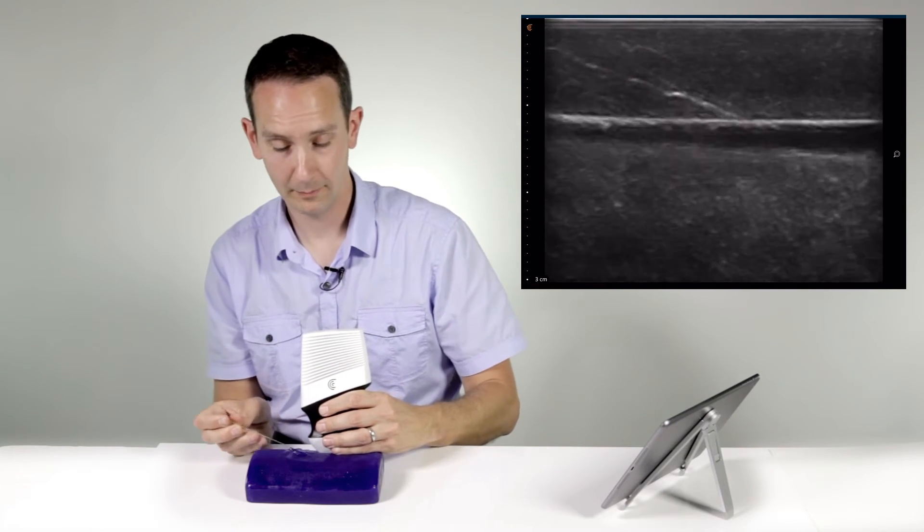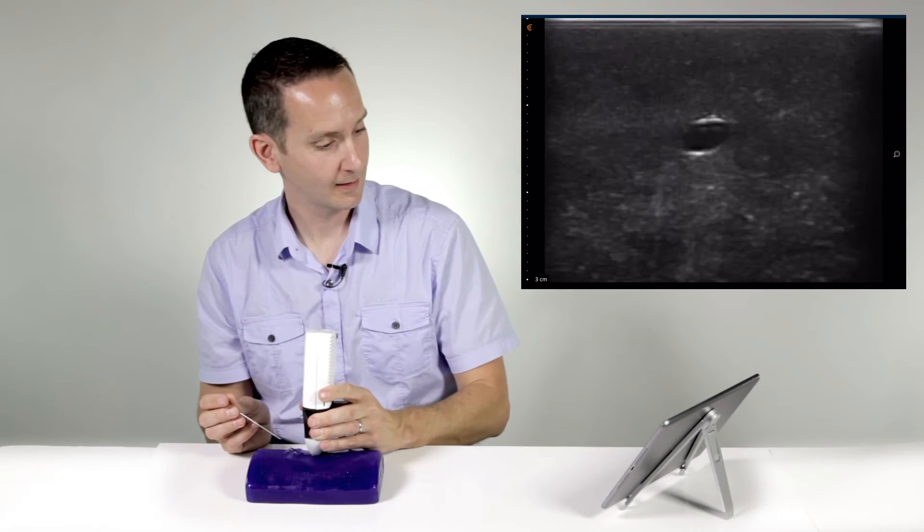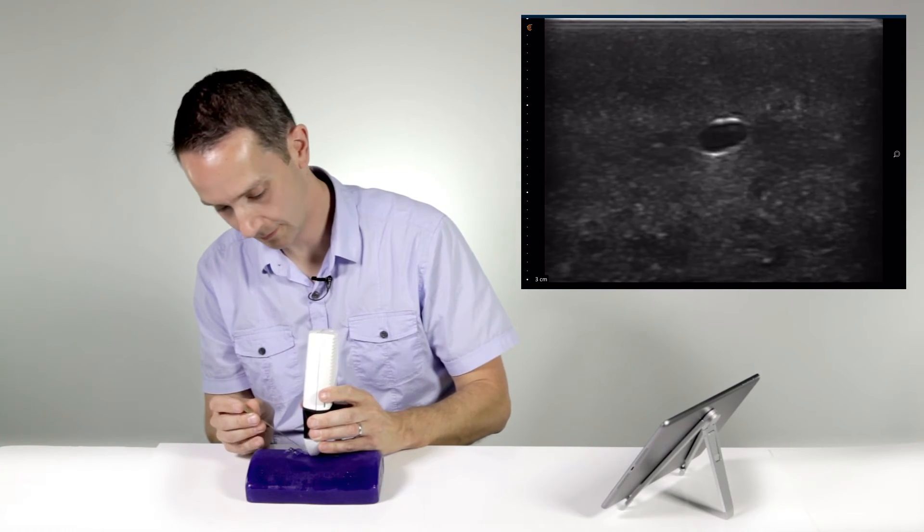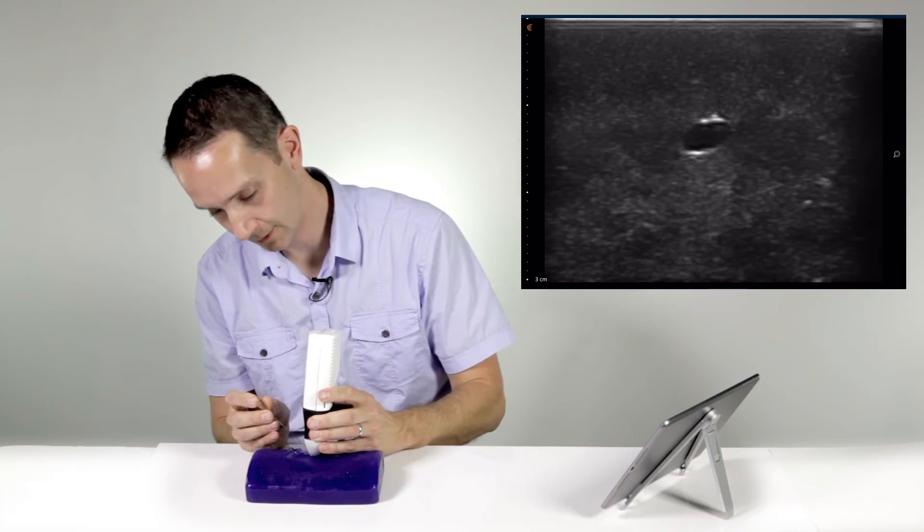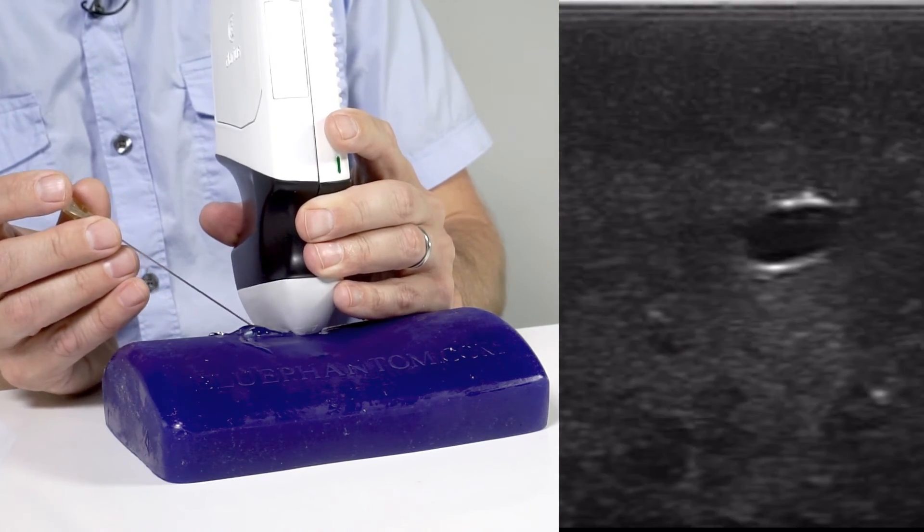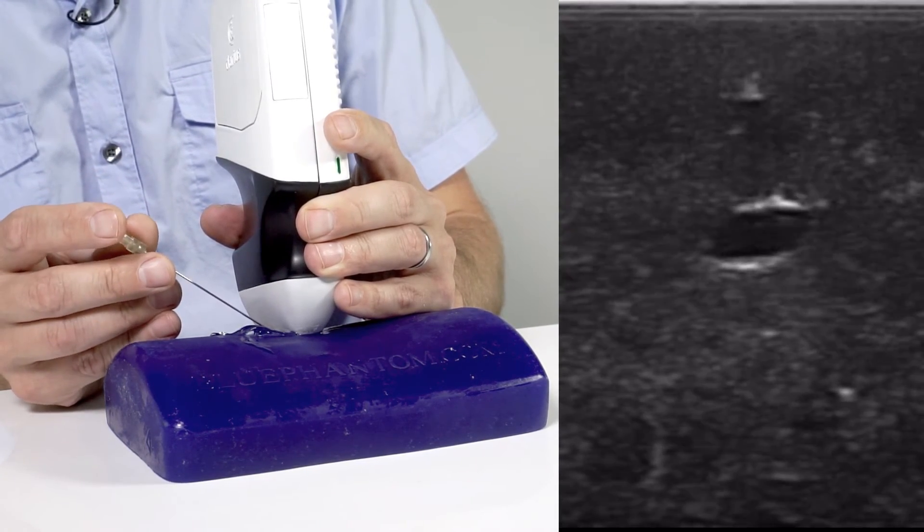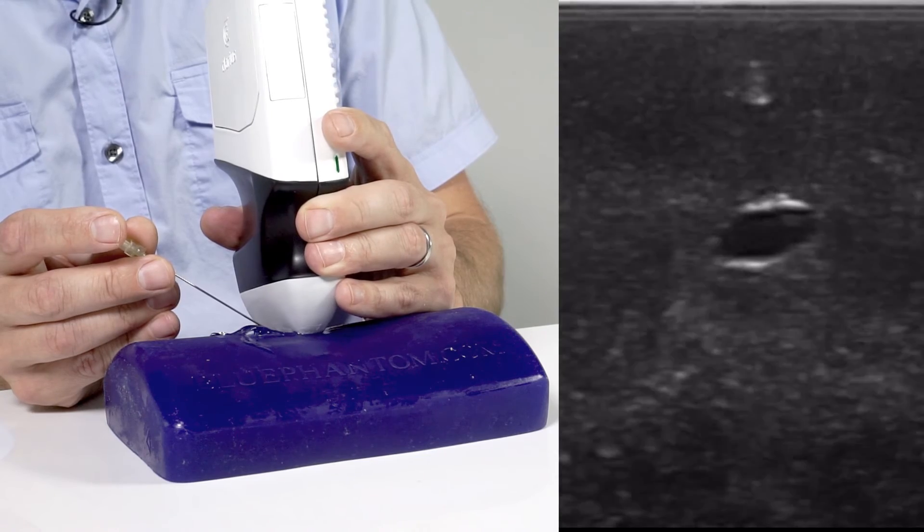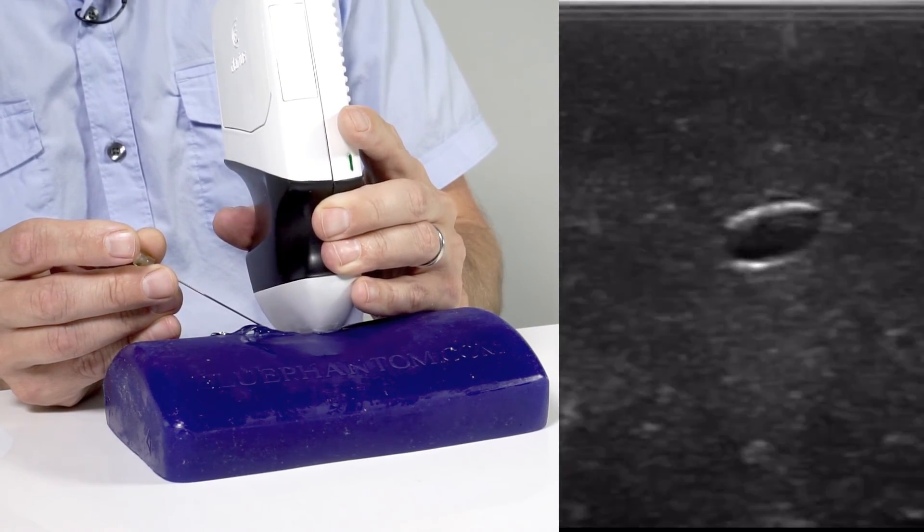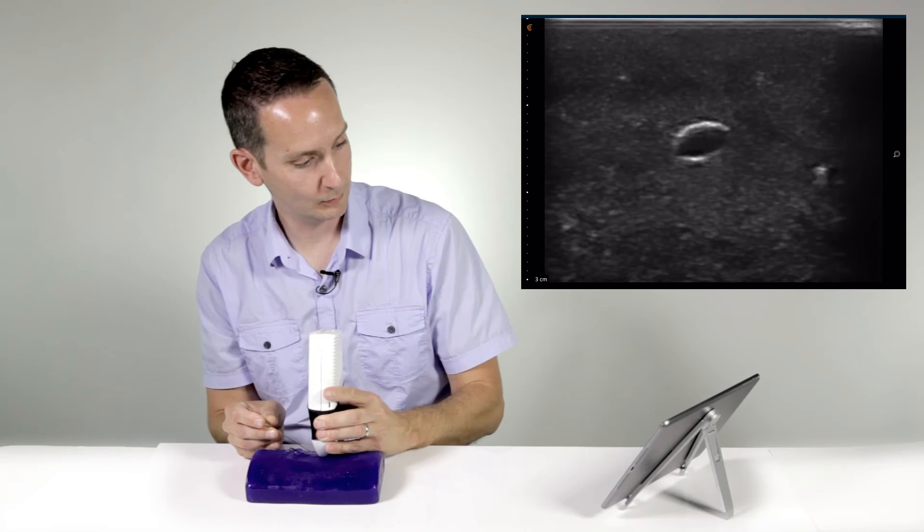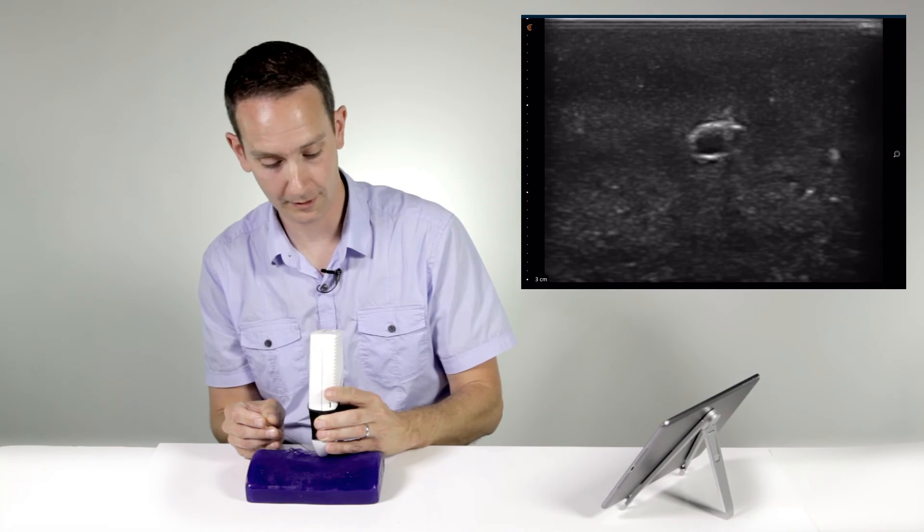A third method combines both the short axis and the long axis. This allows you to make sure that the needle tip is in fact at the superficial vessel wall. So I'm going to start off in the short axis approach and I'm going to identify the needle tip. I'm going to slide the probe away. I'm going to advance, stop, there's my needle tip. I'm going to slide, advance the probe and there I see the wall of the vessel and the needle tip are in contact with each other. I'm going to stop moving the needle.